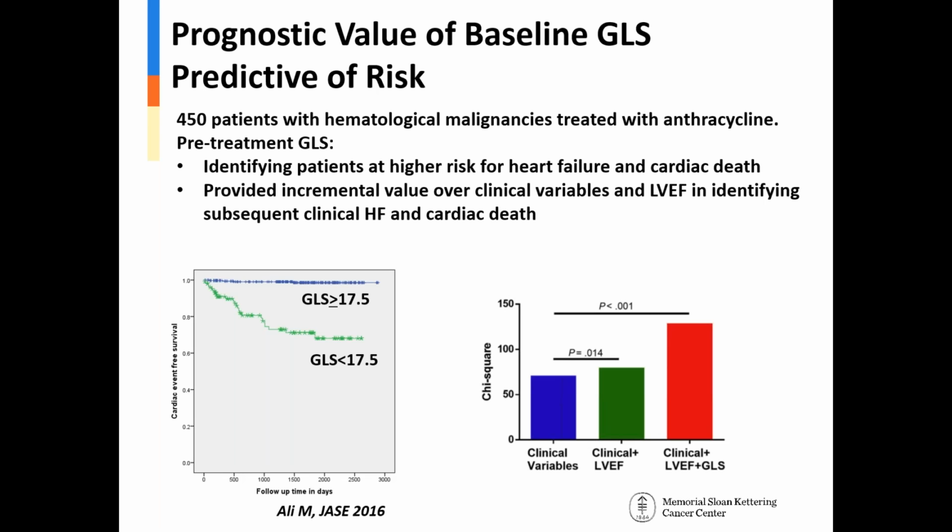But given the curved shape of the ventricle, being off axis will change the contribution of that curved wall into the strain. And it will potentially give a great strain because it's foreshortened. So I was wondering, how do you interpret that aspect of quality? It's almost even more challenging than not seeing something.